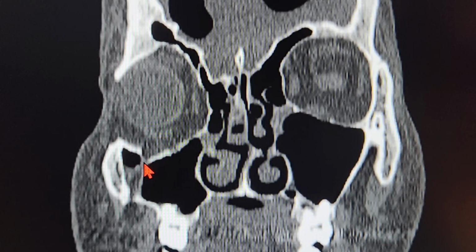So this must be the fracture that the patient acquired from the first accident, because the neurosurgeons cannot go this deep down through the orbit to cause this fracture. So this is basically an abnormally healed fracture from 10 years back from the first RTA, the road traffic accident. So you need to evaluate this as well.